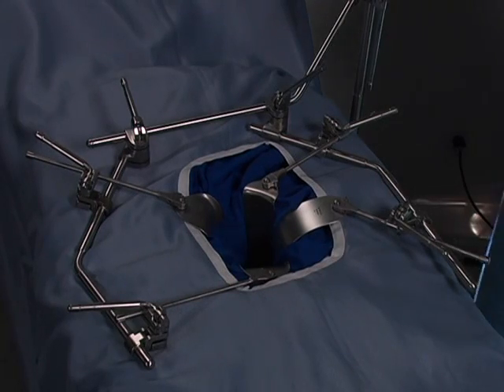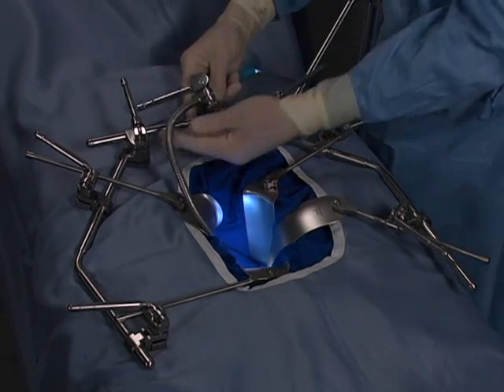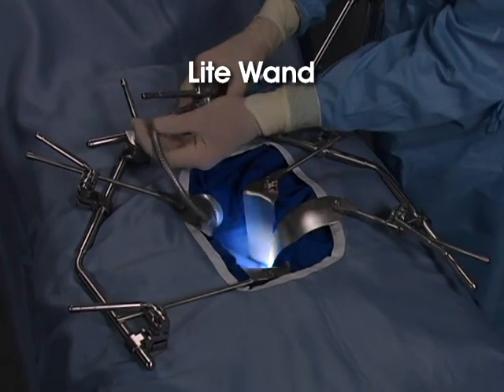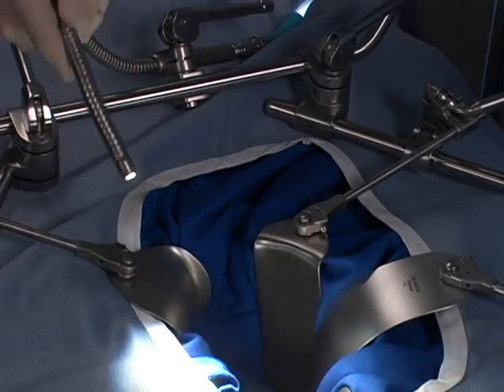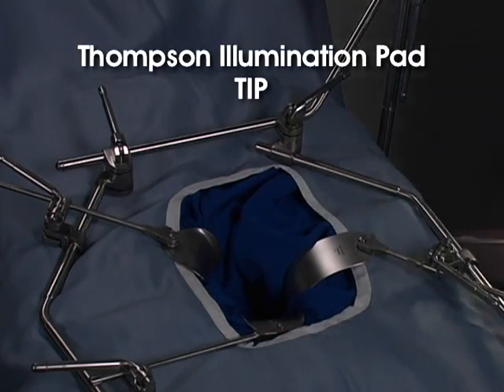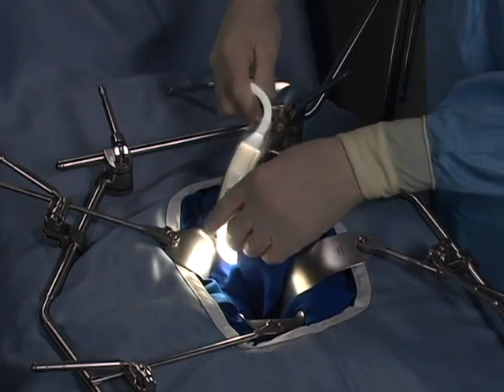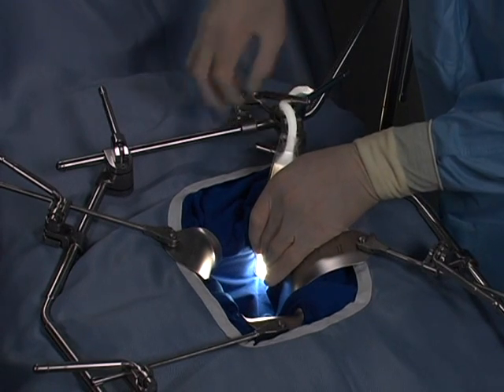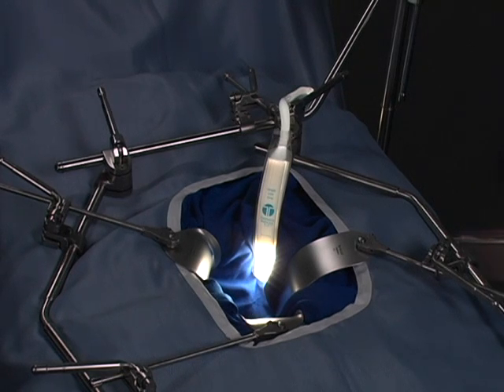Along with the Thompson retractor's phenomenal exposure, we offer two options for bringing cool, bright light into the incision for even greater visibility. The Thompson light wand is a reusable light that can be attached anywhere on the Thompson frame with its quick locking clip joint. Light is directed as desired by adjusting the malleable light. The Thompson illumination pad, or tip, is a single-use light that slides over any 1-inch wide retractor blade. The retractor blade is then placed, providing both exposure and cool light within the incision. Both the Thompson light wand and the tip eliminate the need for a headlamp and enhance visibility.